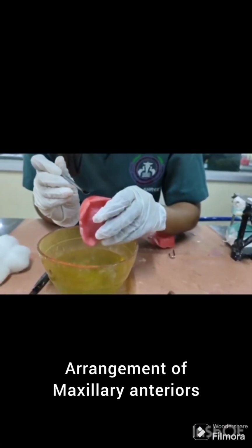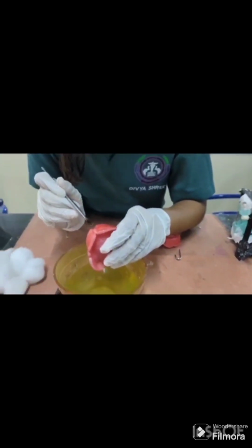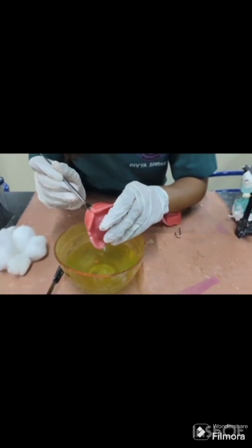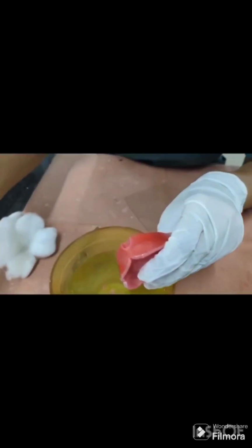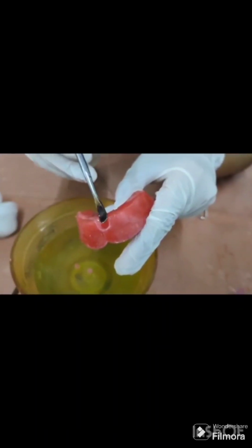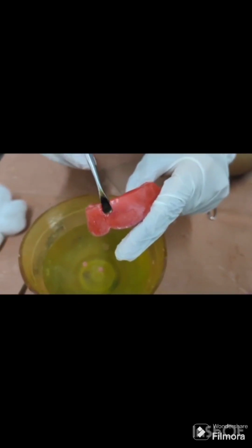These are the requirements for the arrangement of the teeth. First, arrangement of the anterior teeth. Maxillary central incisor. Its long axis inclines slightly towards the vertical axis when viewed from the front. The incisal edge contacts the occlusal plane.